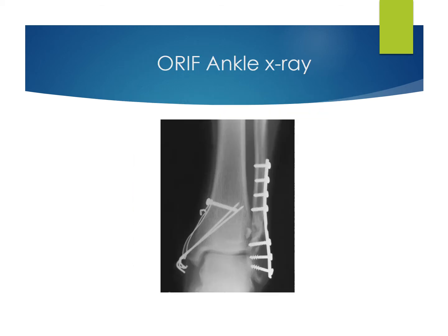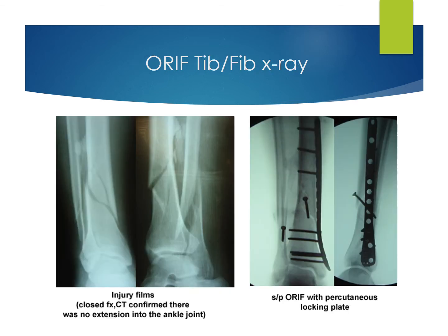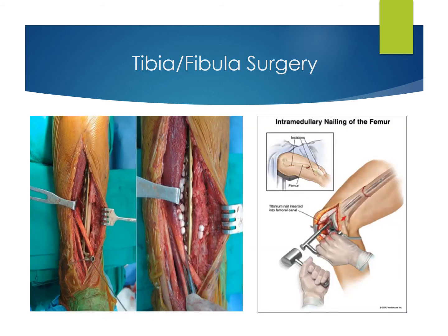An ORIF of the ankle, and during surgery. An ORIF of the tib fib x-ray, and the tib fib during surgery.